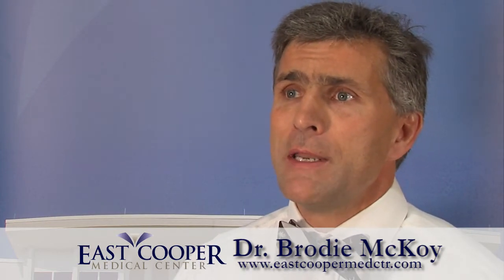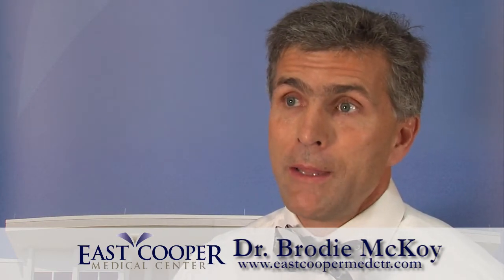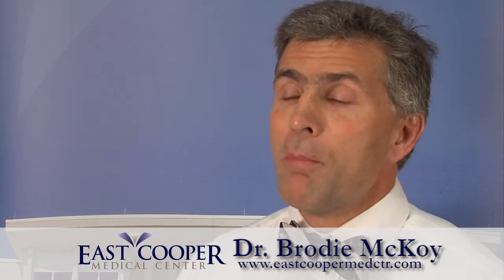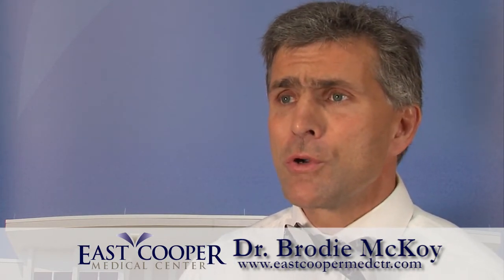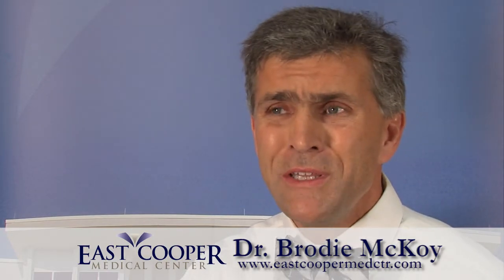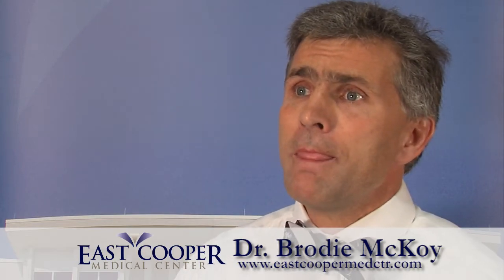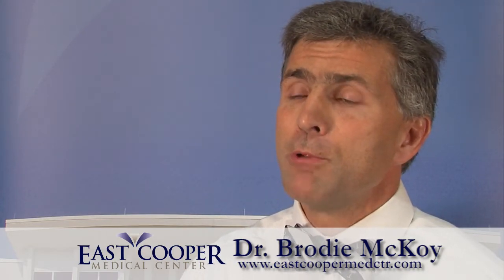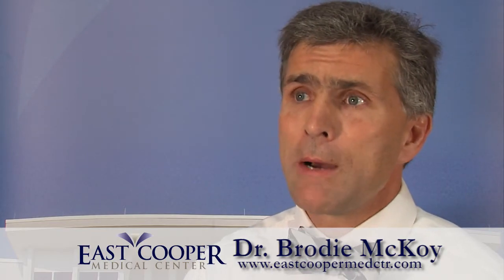This information is fed into a Rio robot. The patient comes to the operating room, we make the incision, the robotic arm is brought in, it's surgeon controlled, and we can use a precise burr to remove only the damaged tissue in the knee. And then we can place the implant exactly where it was planned on the preoperative template and preoperative planning.